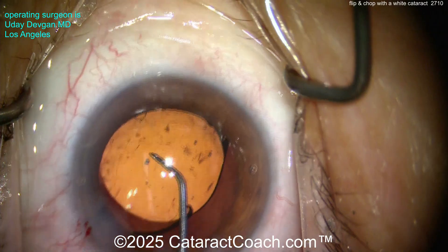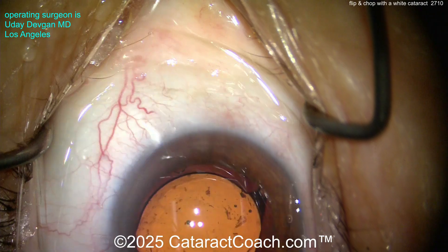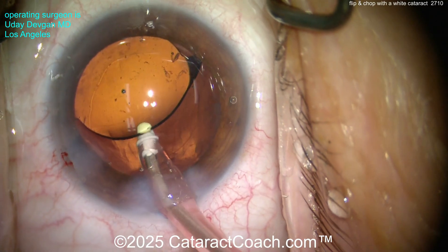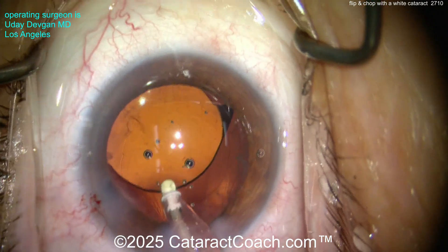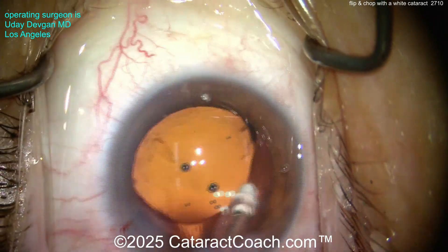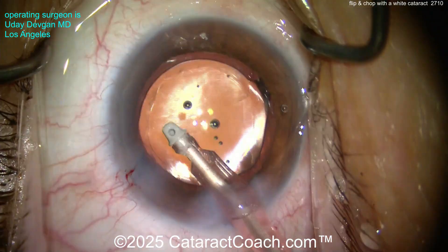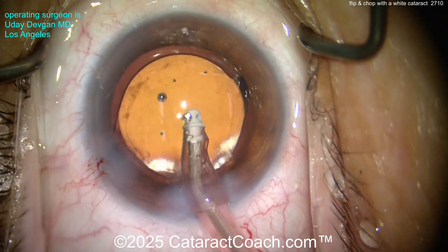I don't do flip and chop for every case. Just this morning I did some patients with vertical chop, horizontal chop, and one very tiny nanophthalmic eye with a shallow anterior chamber where I did a stop and chop with a double-wide groove to debulk the nucleus and give more operating room. So obviously, tailor the technique to the patient. If you haven't learned the basic techniques yet, don't worry about flip and chop — this is not for newbies.